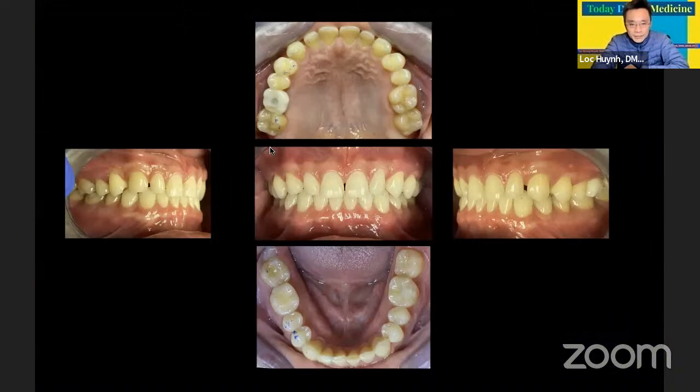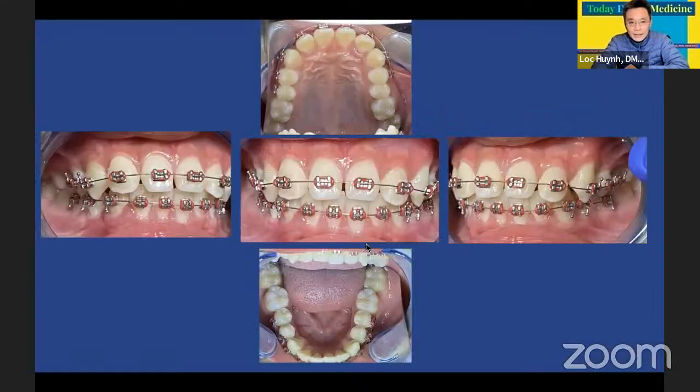And here's an example of an intraoral photo that is considered reasonable and acceptable. For example, you've got to retract everything, and you've got to get the occlusal view, all of them: left, right, and occlusal. I would say this is an acceptable intraoral recording photo. This is another one that's considered a reasonable, acceptable intraoral photo.